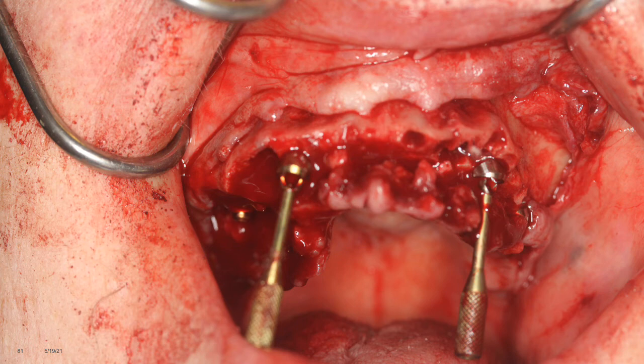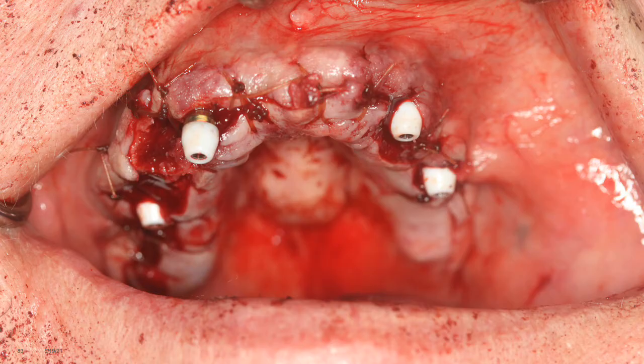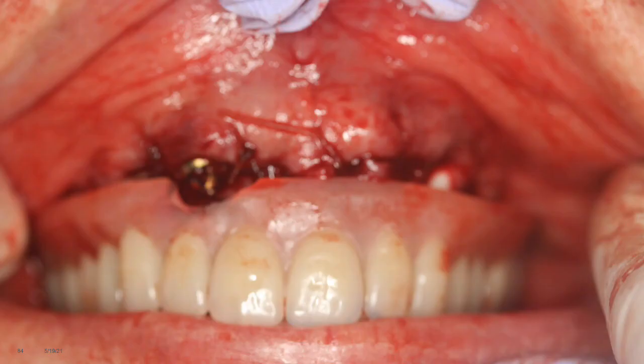Because this is an older case, I put the implants where I felt the best bone that I could reach. What goes on top of these implants are these multi-unit abutments, which help bring the prosthetic surface even palatally, so it will come through the palatal cusp. Then we have this little guide which showed me to make sure that my abutments were angled more palatal and therefore won't exit through the facial. Then we put on these little abutments which help us suture things up. Then with the lab, we start converting the actual denture. So in our office, we do the surgery, and we do the conversion while they're there, while they're comfortable, while they're asleep.